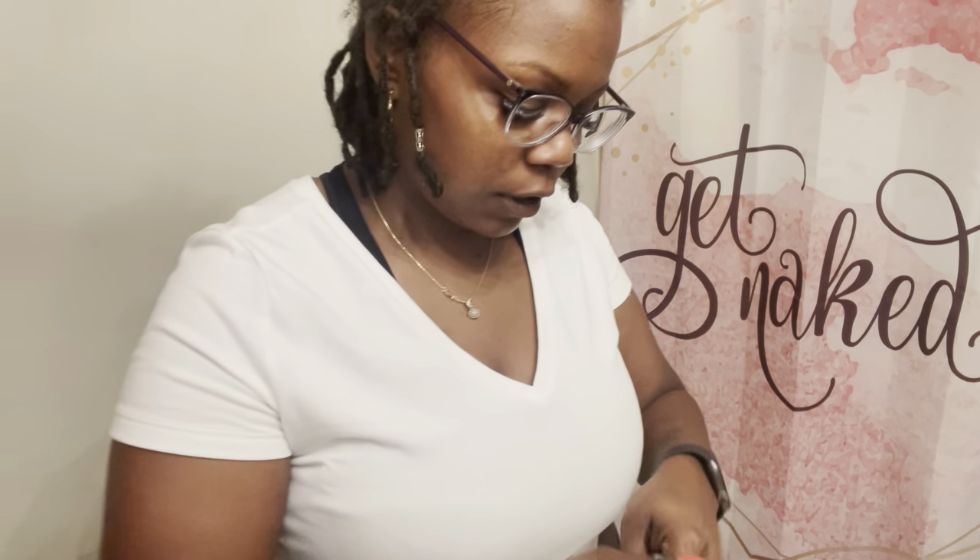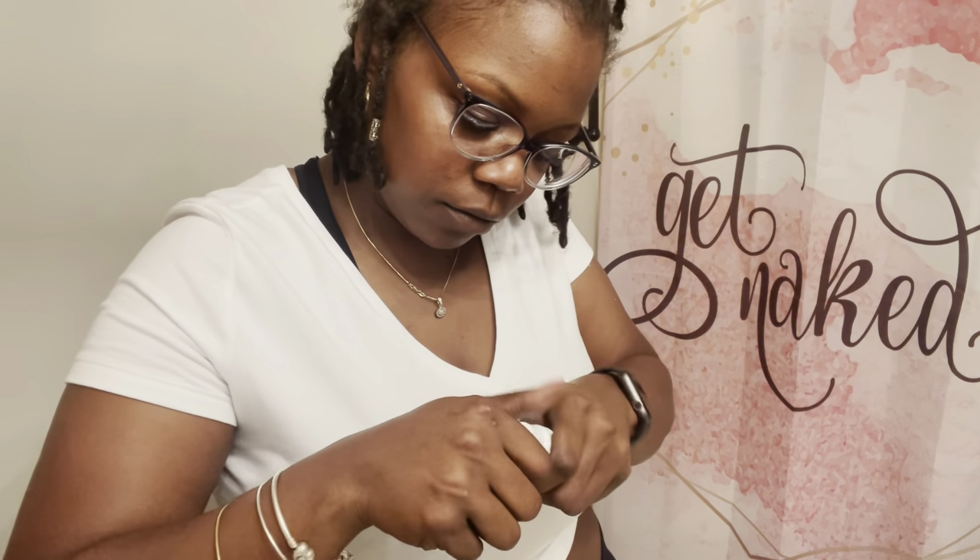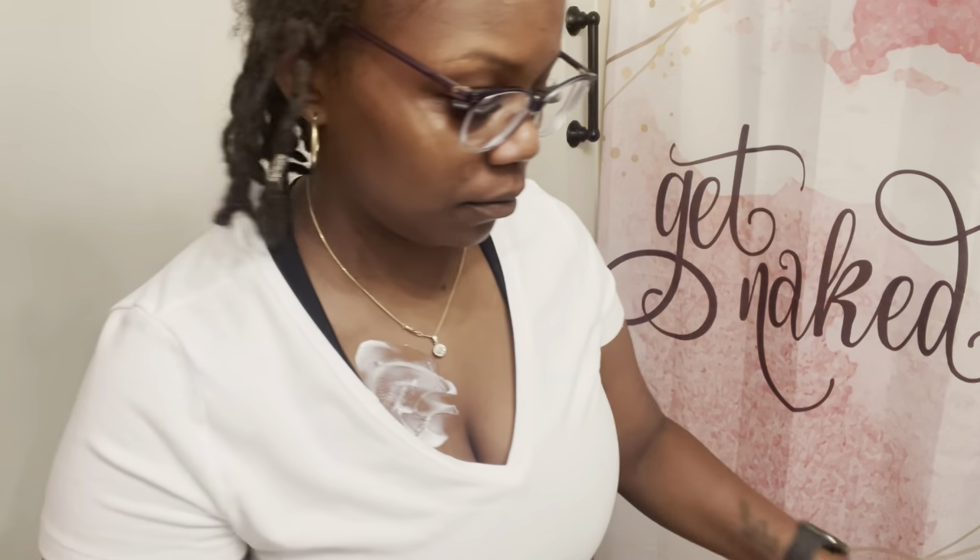So most people put it on and they do like this. This is my port by the way. They put it right here and they rub it - that's wrong. Trust me, I've done it before where I've rubbed it and yeah, it still hurt a little bit.